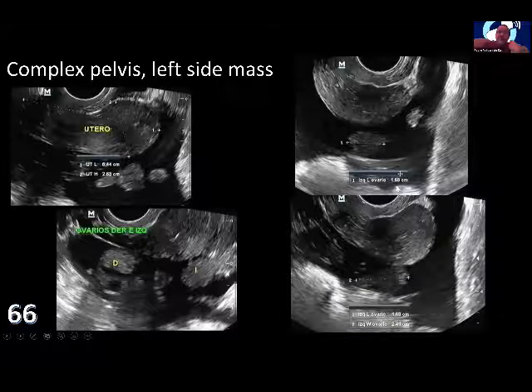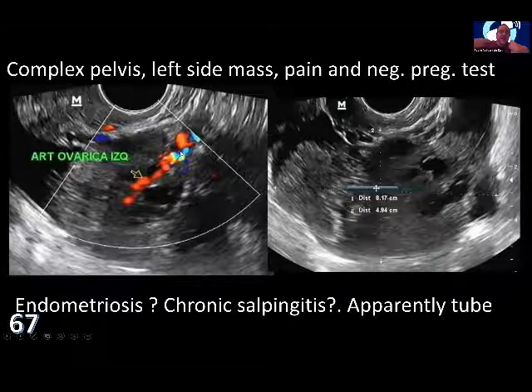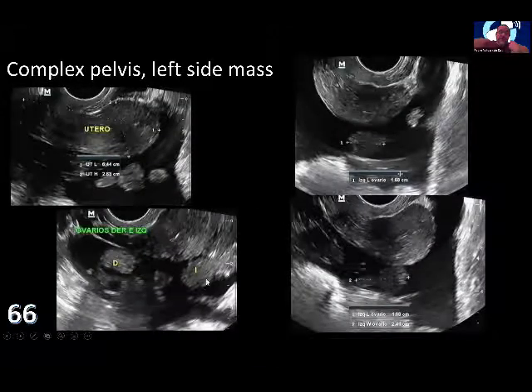This is another difficult diagnosed case of free fluid, right and left ovary, and something, something here surrounding somehow the left ovarian artery. We already saw that the left ovary was normal.